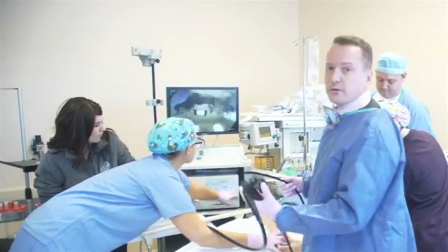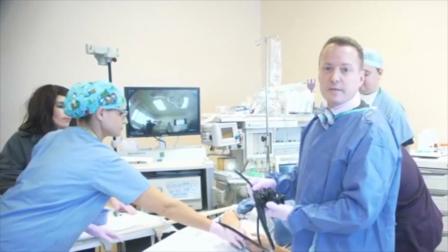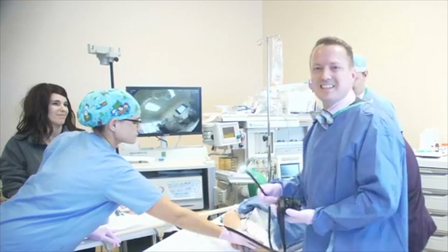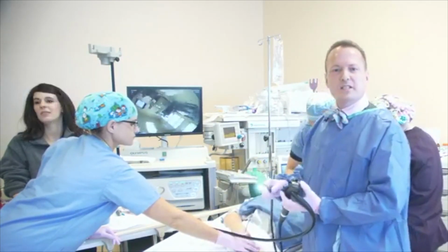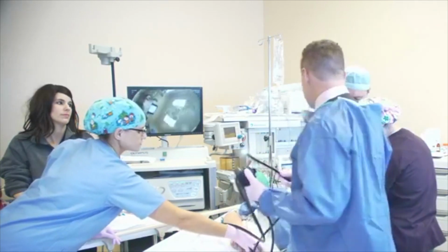It's a sedation procedure, kind of like a colonoscopy or something like that. Not completely asleep. So you may see her move around, maybe even make noises, snoring perhaps, sometimes hiccuping. And as we get the bite block in place, that's just to basically protect the patient's teeth and protect the scope as well.